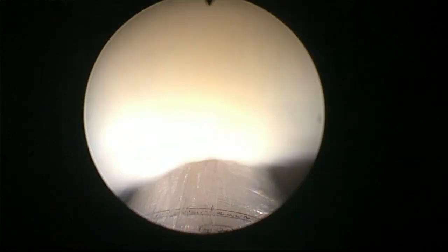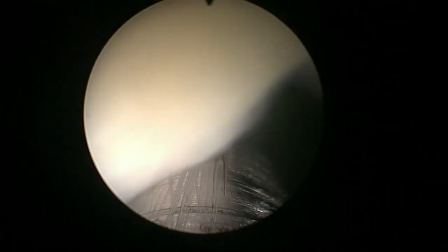No, it's a relatively large gland. It's taking quite a while to morcellate, so I guess we're going to get a lot of tissue out. But the morcellation is very efficient and very happy.